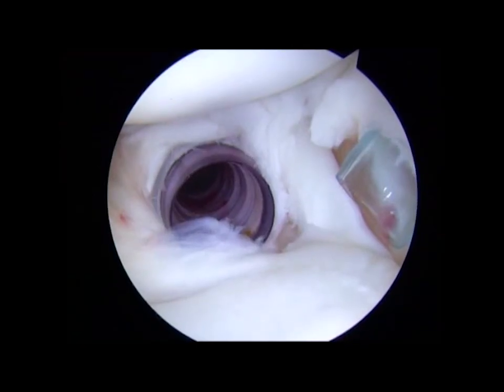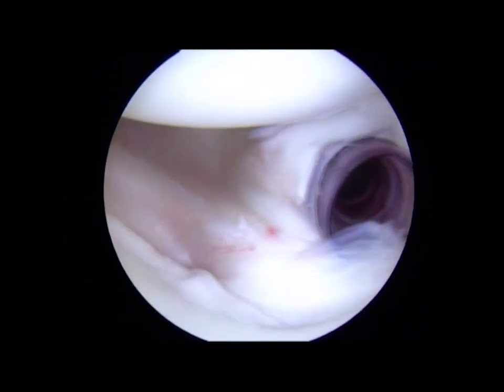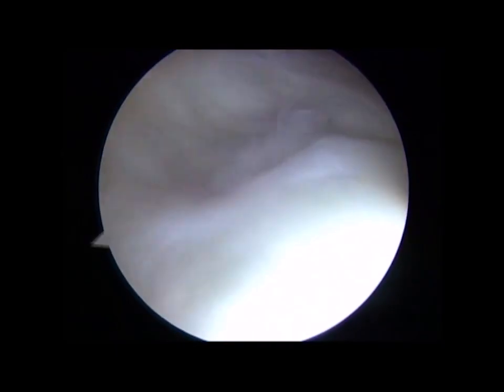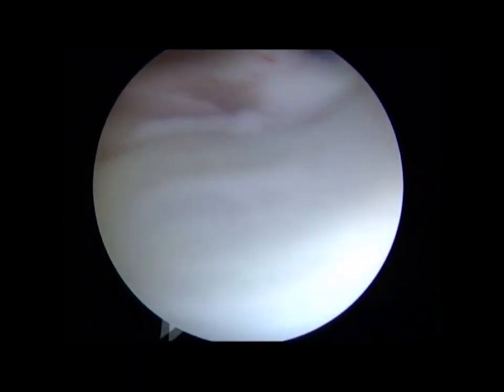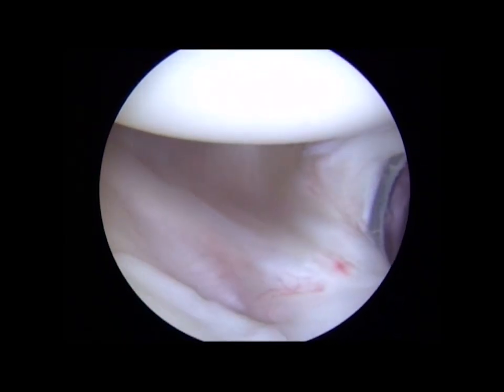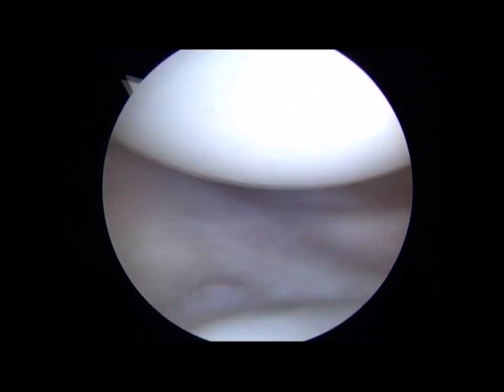Patients with multidirectional instability may have concurrent labral pathology, but many do not. As we can see in this patient, left shoulder lateral decubitus position, there's significant patulousness to the capsule in this patient with multidirectional instability, but no labral pathology.